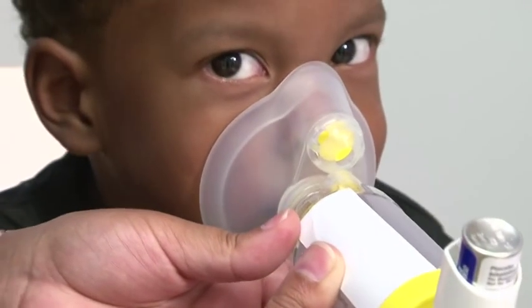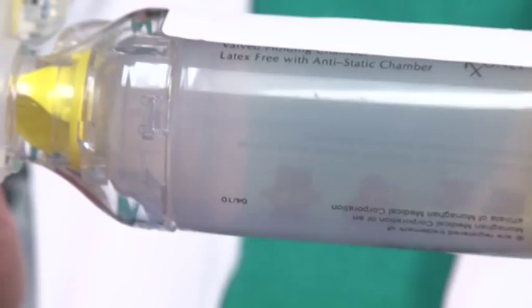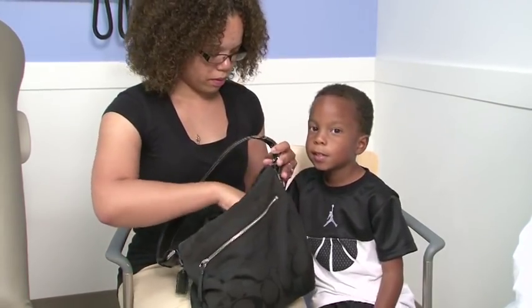Metered dose inhalers, which are also commonly called puffers or inhalers, spray the medicine out so that you can breathe it deep into the lungs. Inhalers deliver medicine very quickly. Inhalers are compact and light, so they can be easily taken with you wherever you go.